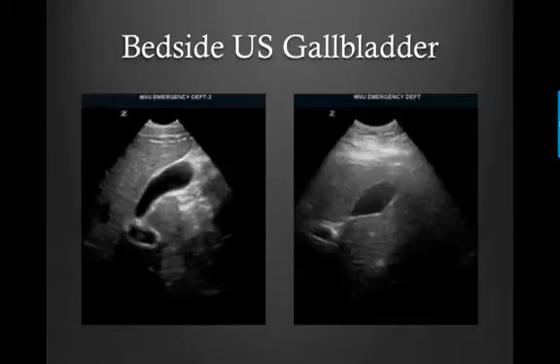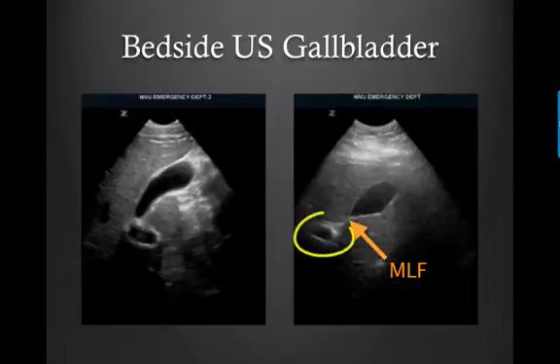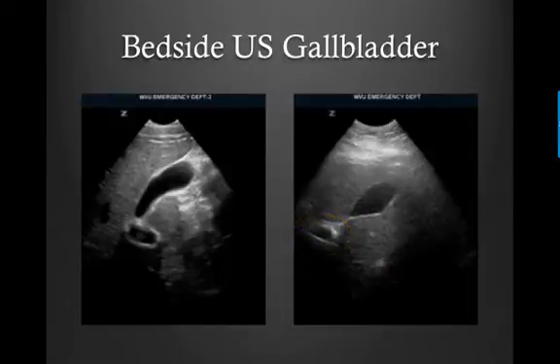Here are a few images of normal gallbladders. We can see the median lobar fissure connecting to the portal triad, which lets us know we are definitely looking at the gallbladder. The walls look nice and thin, and again you're going to measure the anterior wall. There's no evidence of sludge or stone, and there's no pericholecystic fluid.